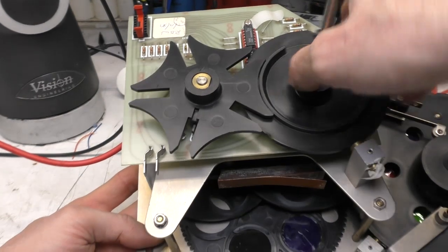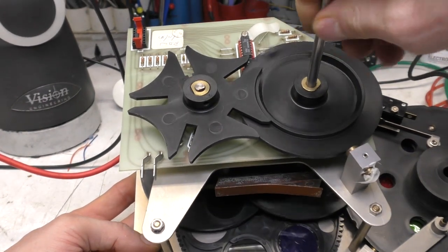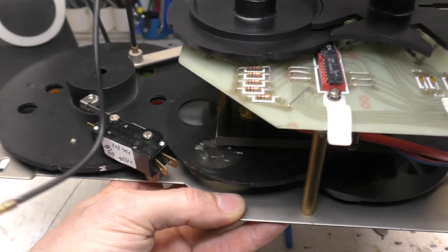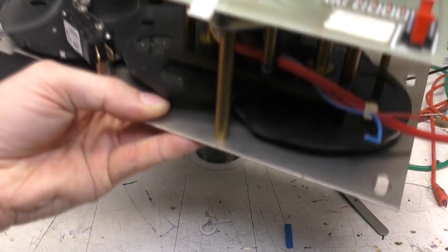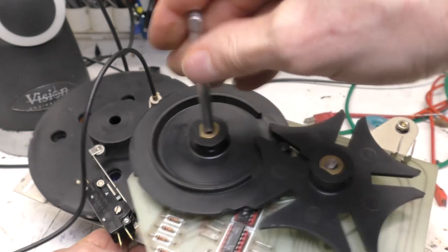So this is the optical density control. So we've got two separate filter wheels. You can see the filter wheels down here. So we've got a fine one here, and then the coarse one here that rotates each time we step the fine one with this mechanism.